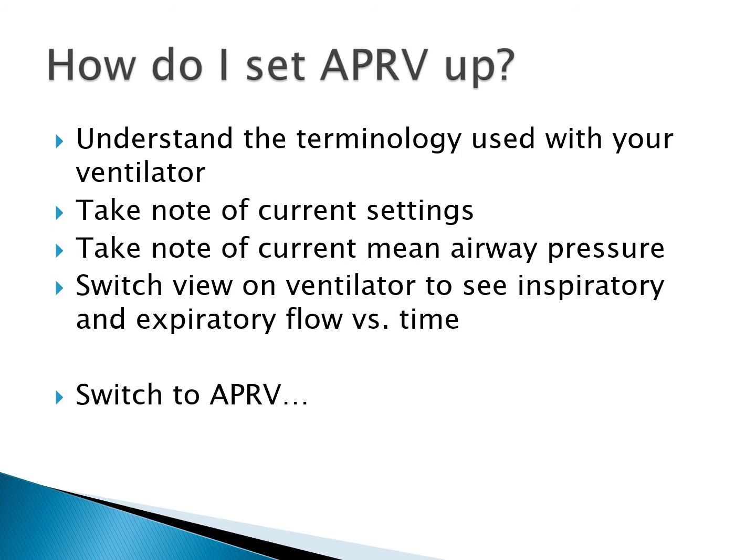Then take a note of your current mean airway pressure on the ventilator, and then ensure that the view you have on the screen of your ventilator allows you to see inspiratory and expiratory flow versus time graphs. Then switch to APRV.